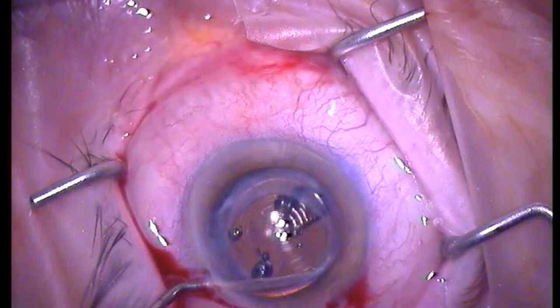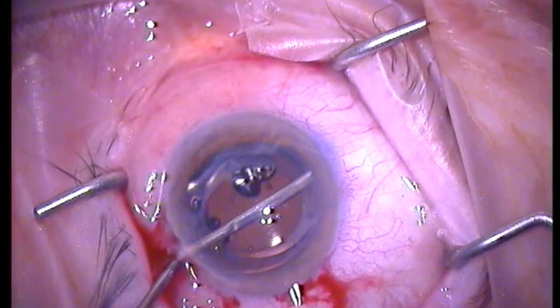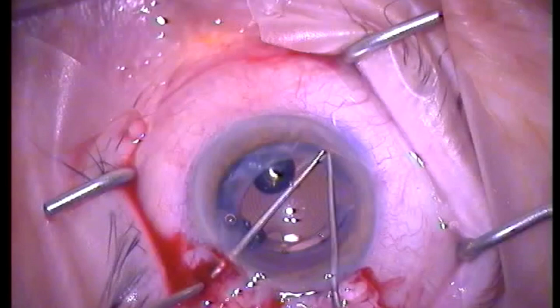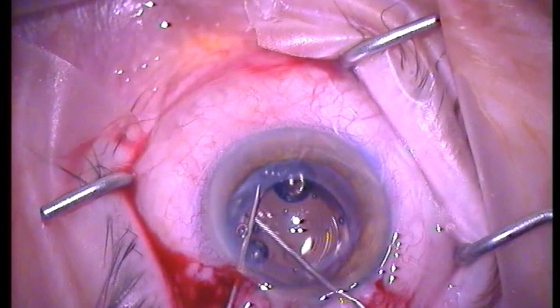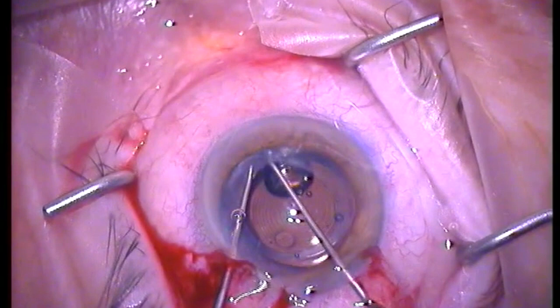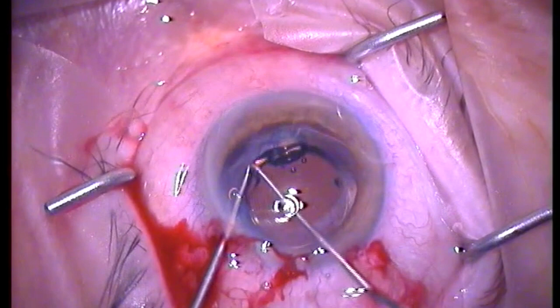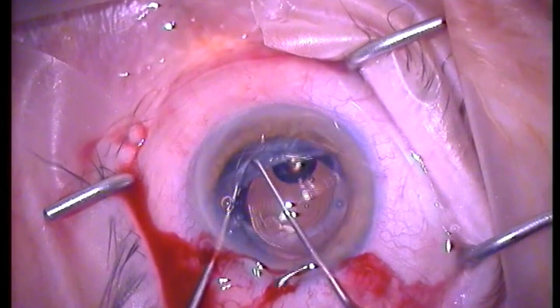I always leave a little bit of a bubble underneath the lens to allow for better visualization of the posterior capsule, and then the lens is dislocated into the AC by rotating it safely out of the bag — as you can see here by lifting the distal haptic outside the bag and then rotating it. The same will follow through for the proximal haptic.